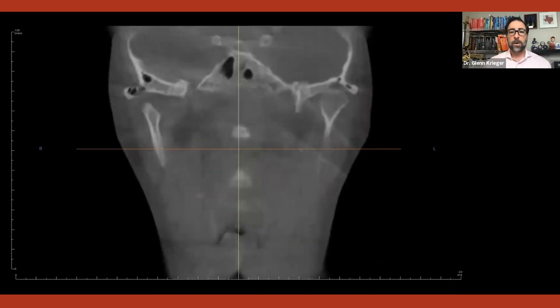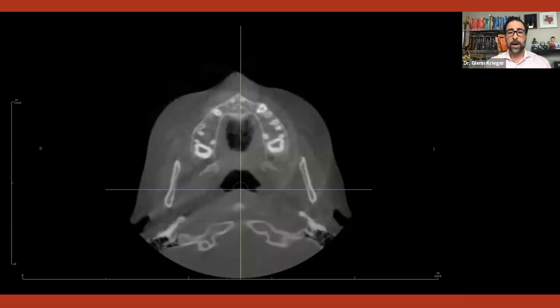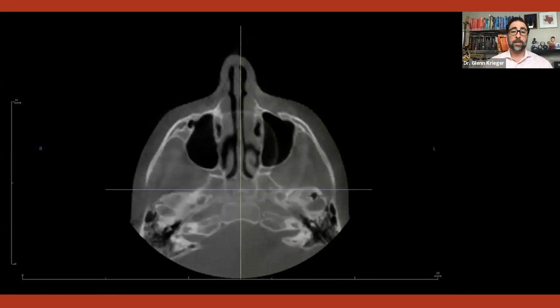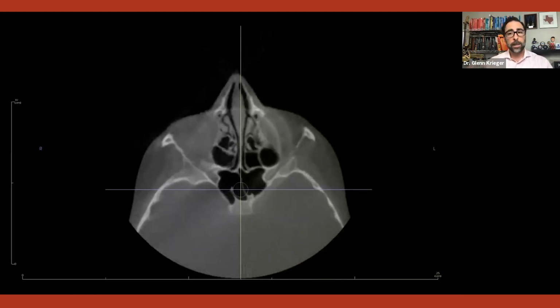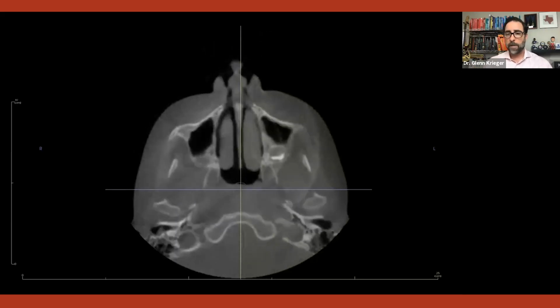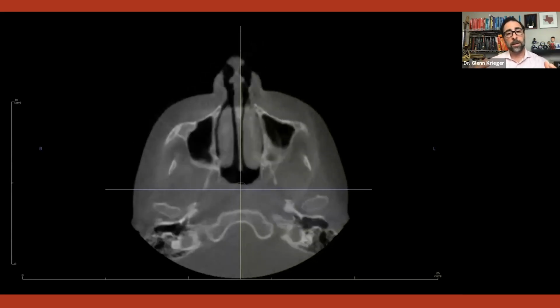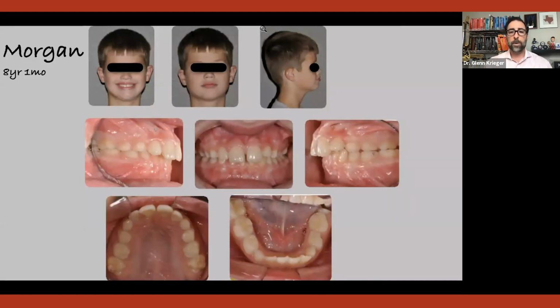And so when I was done looking at this, look at the joint, for instance, as you're seeing right there, to be able to look up into the nasal floor, which is a very large part of my airway-driven practice. And I'm going to get a little bit into airway today. I'm not going to touch on it a lot because it's a very, very broad topic that you just can't learn standing on one foot. But again, this is the world I now live in, as opposed to the regular lateral ceph world that many of us live in.